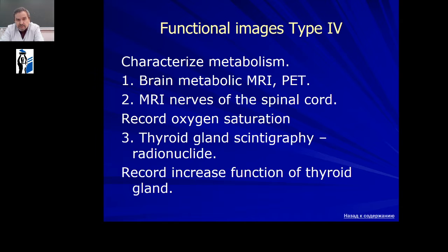Another type, MRI of nerves of spinal cord. The first and second examples record oxygen saturation of brain or nerves.